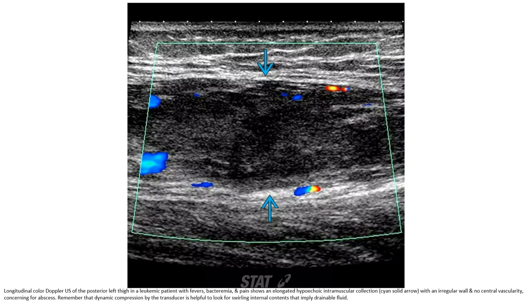This is a color ultrasound image of the posterior thigh in a leukemic patient with fever and pain, showing an elongated hypoechoic intramuscular collection with internal echoes and no central vascularity, concerning for abscess. Dynamic compression by the transducer is helpful to look for swirling internal content, which implies fluid.